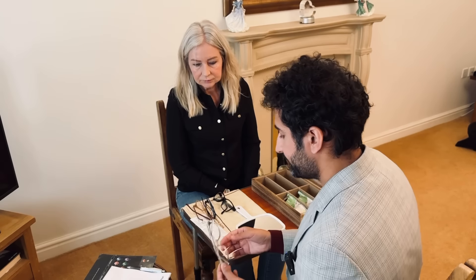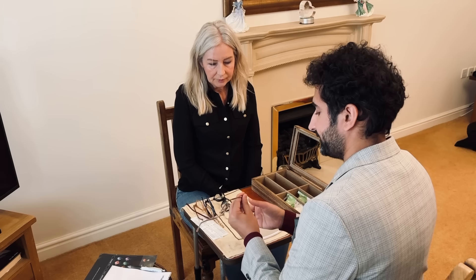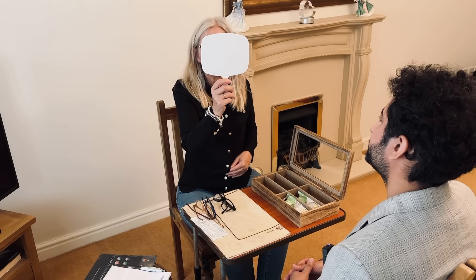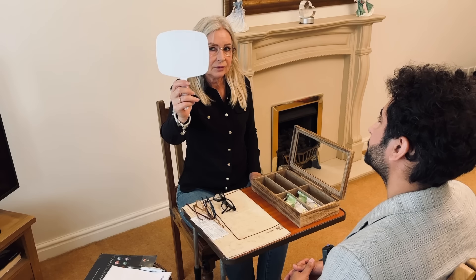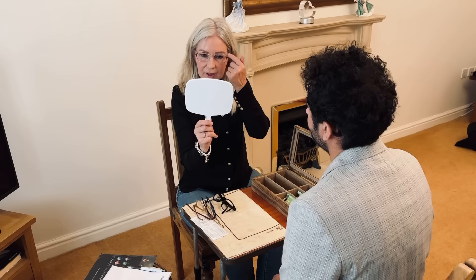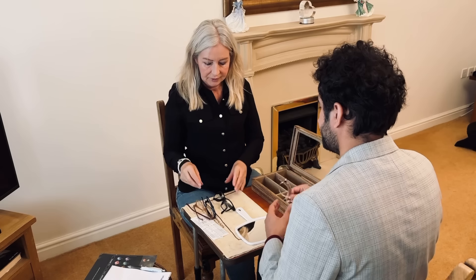Okay, the fourth pair is even lighter. It also has a translucent effect with touches of maroon. Okay, and the designs are there — have a look at those, try them on. Again, it's a pair you wouldn't have considered before in terms of colour. It's different. It's very subtle compared to the first two. Not quite sure. Yeah, I like the shape, but I'm not sure — I prefer a little darker.